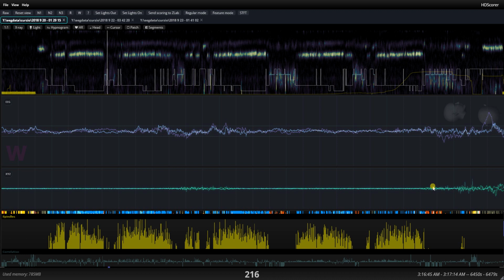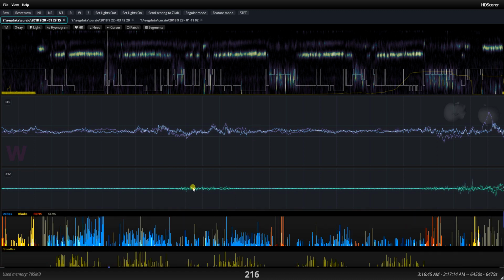One of the things I can do better than regular EEGs, having an accelerometer on board of Zmax, is figure out where the actual movement occurred. So you normally see movement on the EEG because the sensor is going to disarray, but I can do a much more precise job with an accelerometer. So what I've done now is to adopt some kind of compromise between pointing out all the movements on one side and having some type of AASM compatible system on the other.